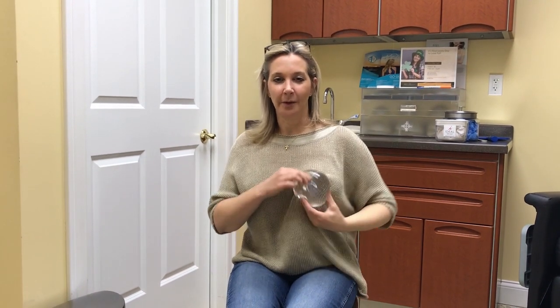So when you flex or reach up into a cabinet or open a drawer and you activate that pec muscle, you could feel your implant going like this, and it aggravated me to no end. So when I went back for my second operation, my wonderful plastic surgeon who did my surgery put my muscle back down and put my implants above the muscle, and I've been great ever since. And it was such a relief for me.